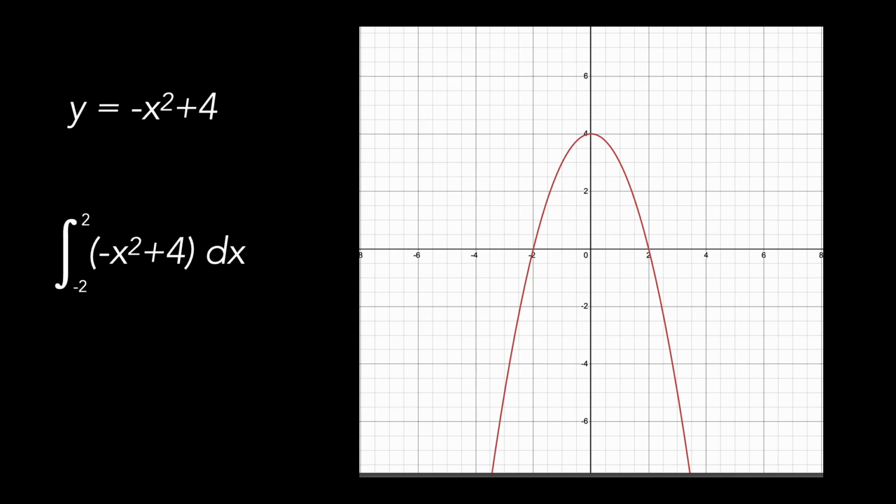Well, I am trying to have a refresher of high school and college calculus, but that's kind of the theory behind that, right? And so we can have this whole measurement of those boxes under the curve. Just like we see here, we can plug that into the integral formula saying, I want to measure it from -2 to +2. What's the whole area under that curve? Give me that. We're going to plug it into a formula and we're going to find a volume.